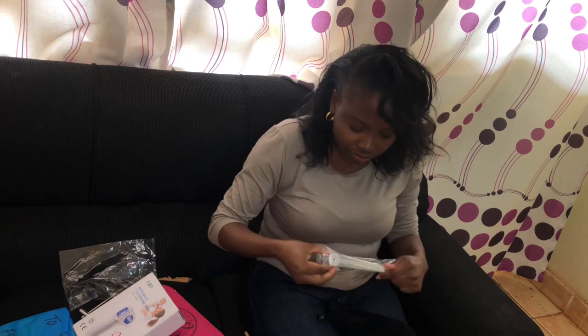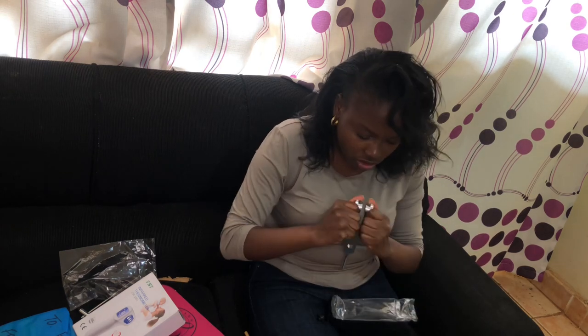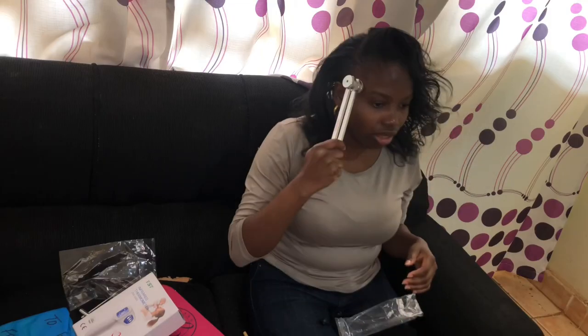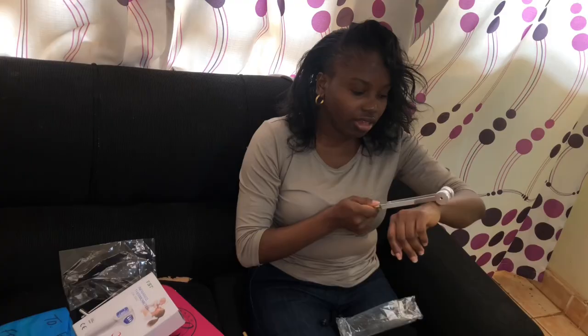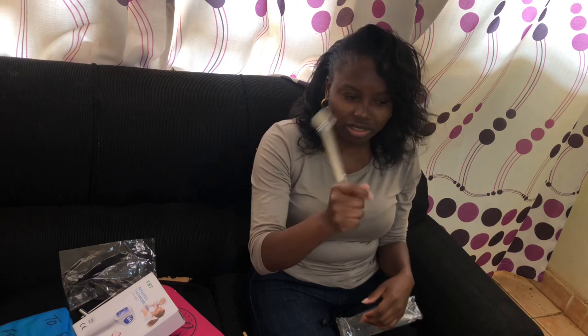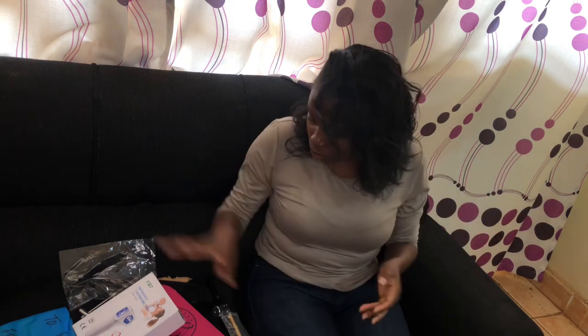This one is a tuning fork. Tuning fork for vibrations and all those sensory things, neurological examination. We need this. I'm saying like, I'm not sure. So this is a tuning fork for sensory things. You don't need to know more. That's all.